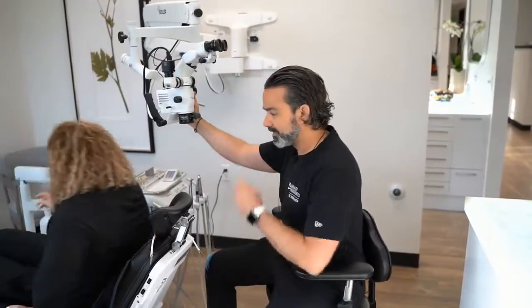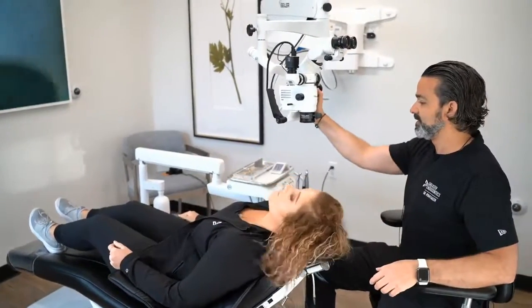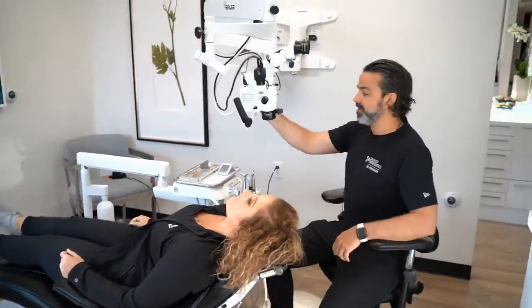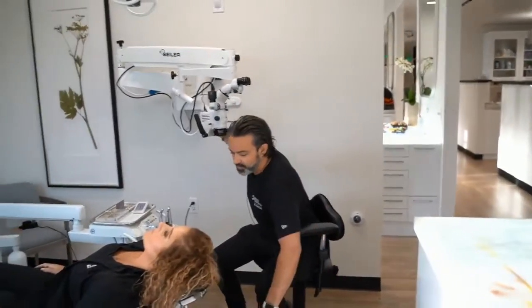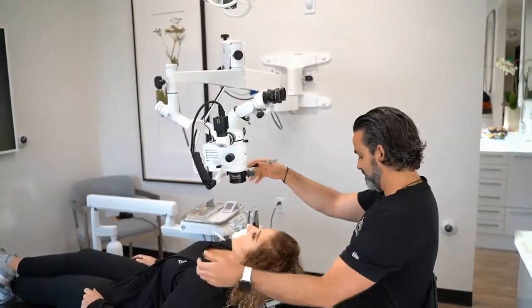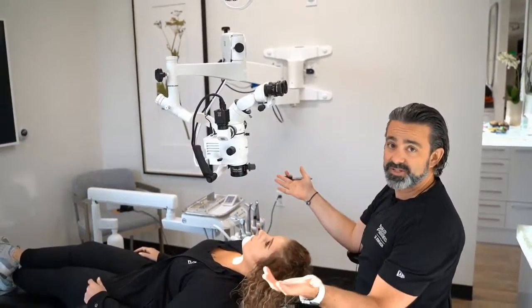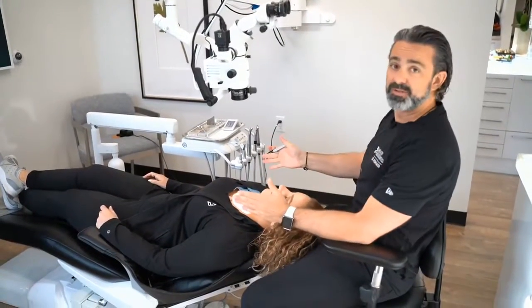So I can put my patient down. Rest your head back, please. And this way, I'm always in this motion. I'm sitting, it's very comfortable. I can bring it over. And the first thing that I'm going to do is position my patient, but I'm going to position my patient in my lap.